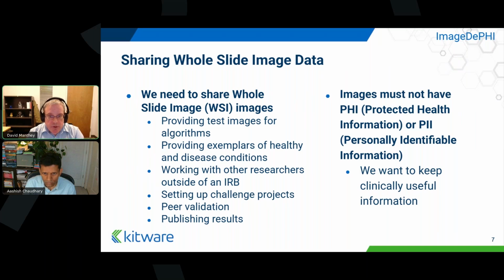While we want to remove protected health information and personally identifiable information from images, we do also want to keep clinically useful information. And I'll be touching on that a bunch as we go forward. But this is things like you might need to know the age of the patient, or obviously things like gender and disease condition. And if that's stored as metadata inside your image, you want to keep it. But at the same point, you need to remove anything identifiable.